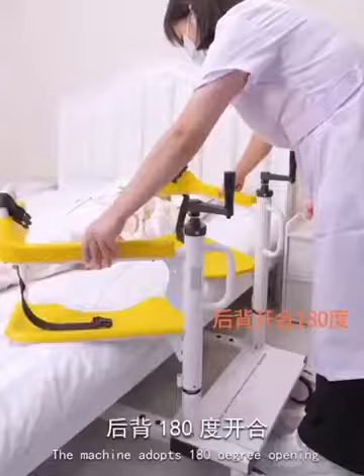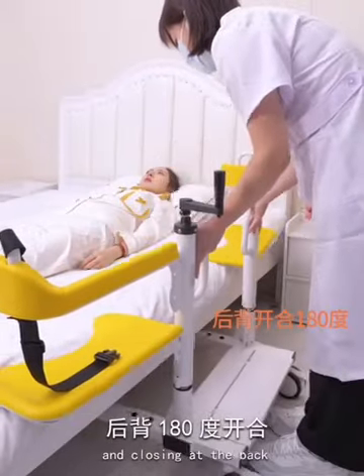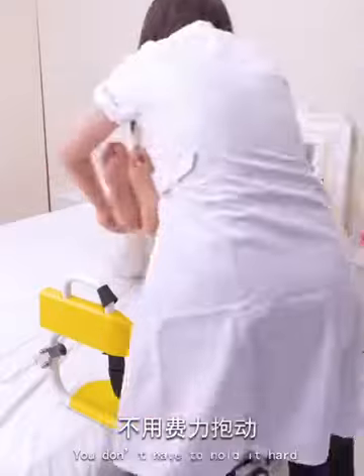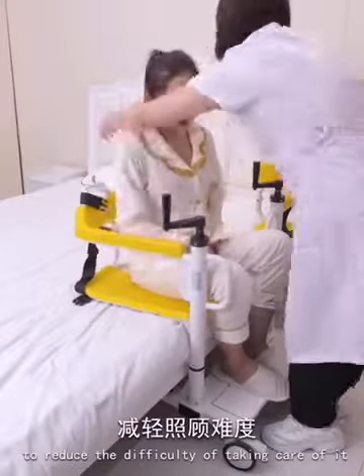Save effort and worry. The machine adopts 180-degree opening and closing at the back, convenient in and out. You don't have to hold it hard — it's easy to operate alone to reduce the difficulty of taking care of it.